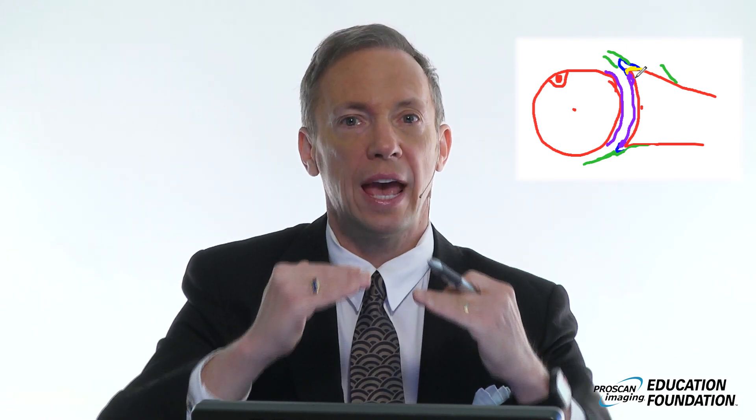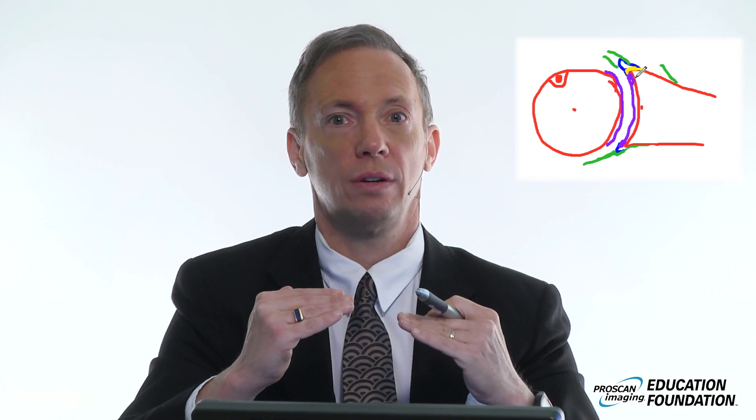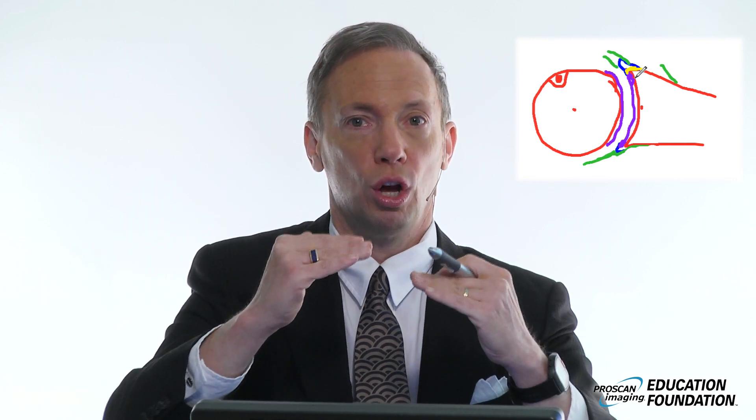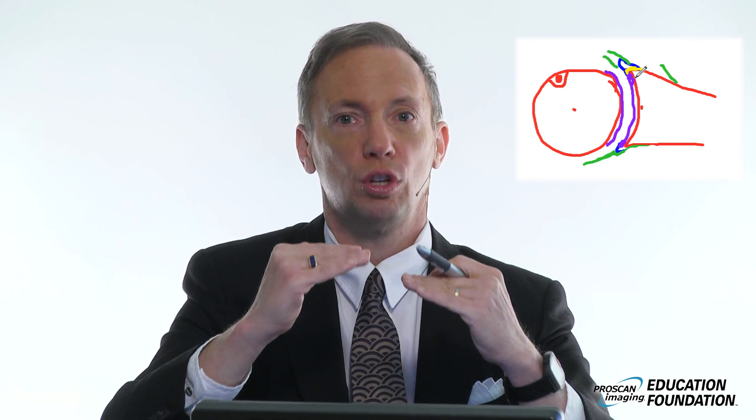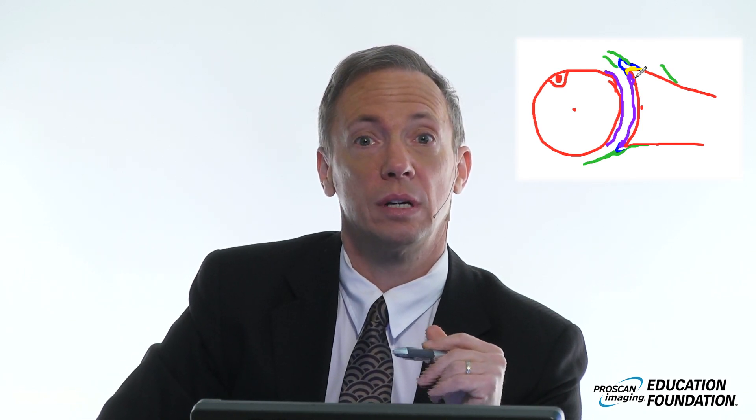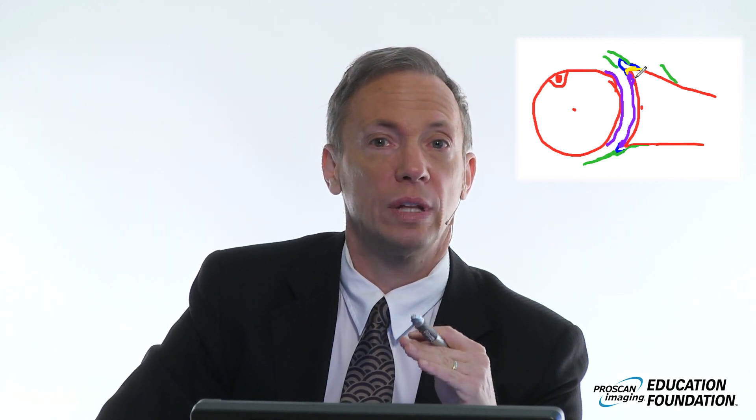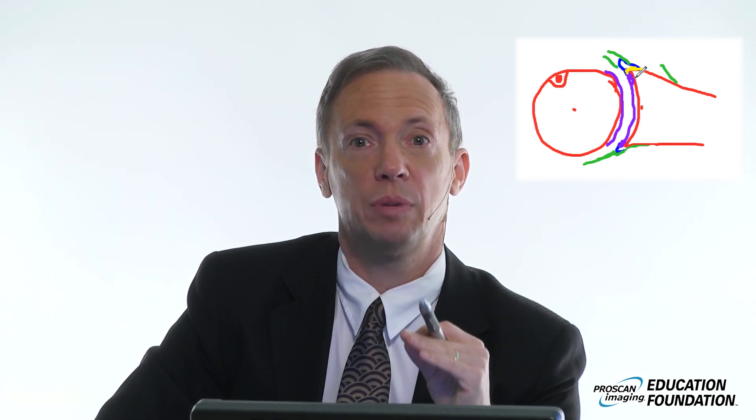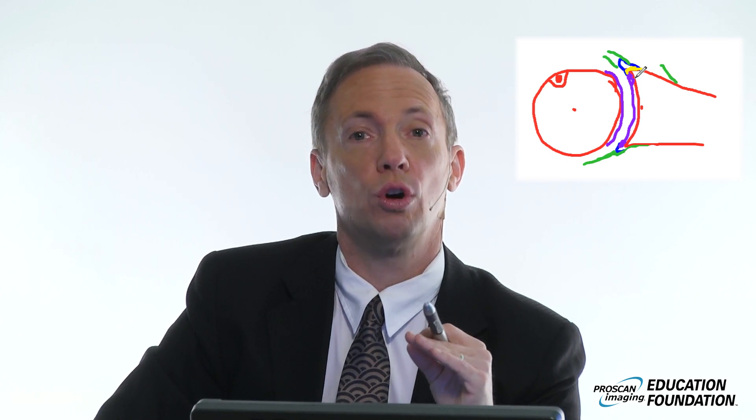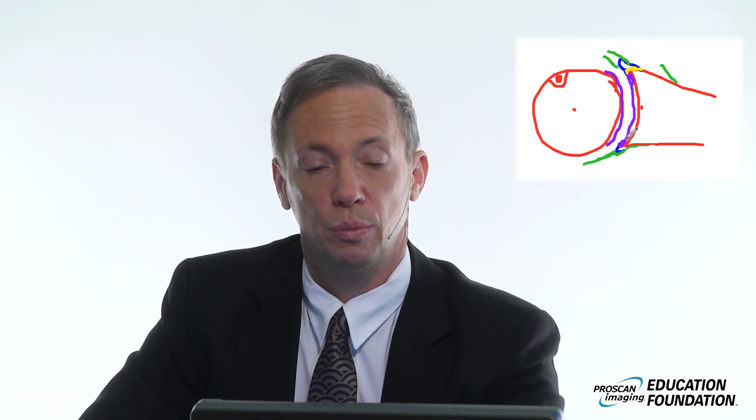The variations are going to be above the humeral and glenoid equator. The true tears, the flap tears, the partial thickness tears, the Bankart lesions are going to be below the equator of the humeral head and the glenoid. Now in the back, this is a less consistent phenomenon. In fact, in the back, we don't like to see any deep clefts, although we will see the purple hyaline cartilage undercutting the posterior labrum.